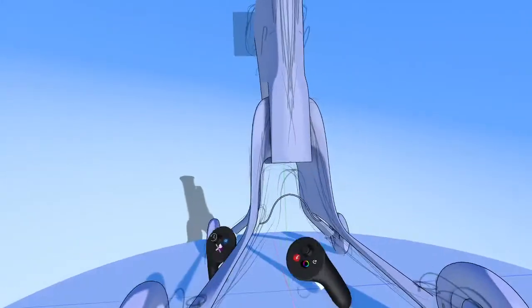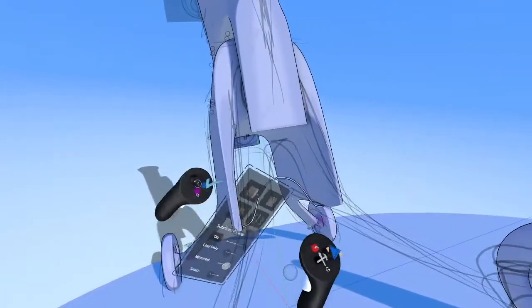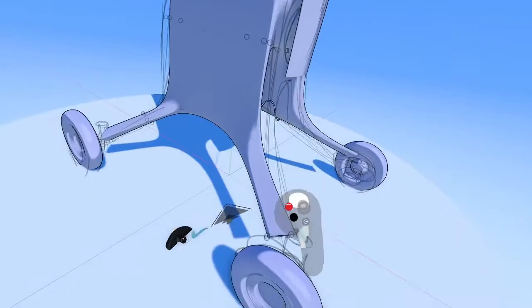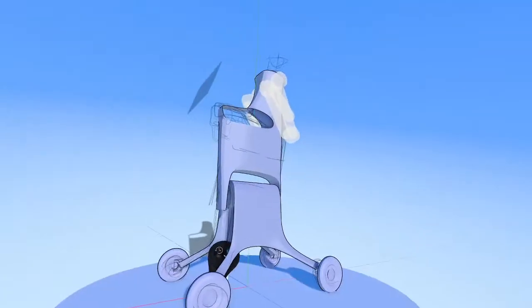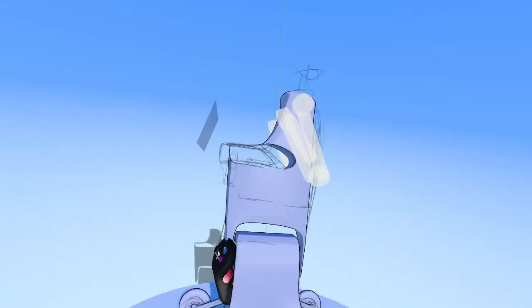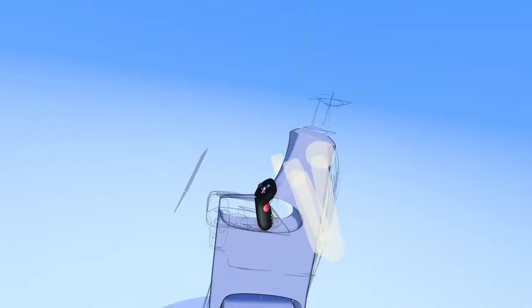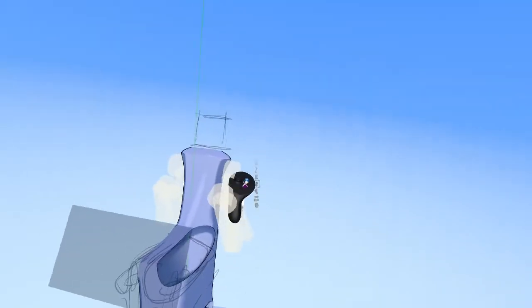And now we have those very natural looking, or not natural looking, but gestural legs coming out here. Just like that. We're going to worry about where that connects to the pivot point in a little bit. And yeah, now let's work on the arms, the fun stuff. So here's what we're going to do for the arms.